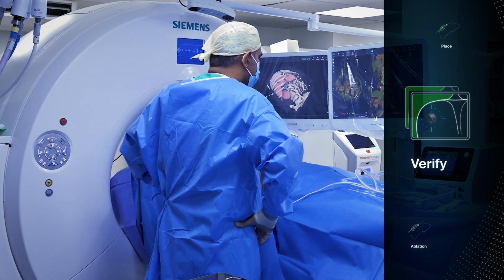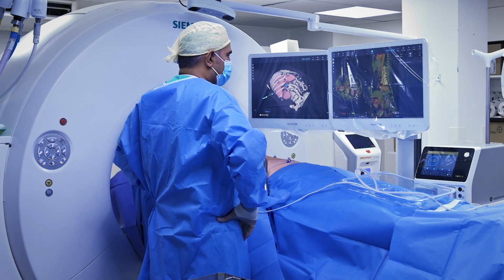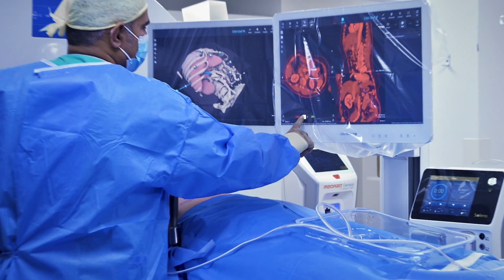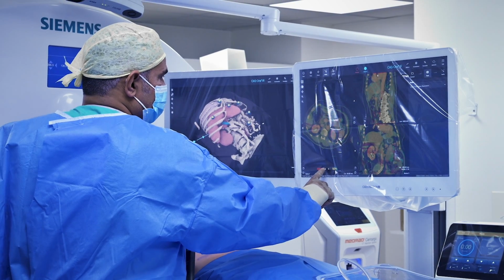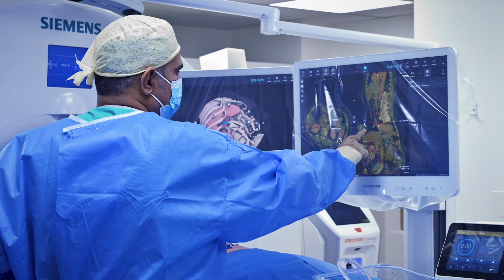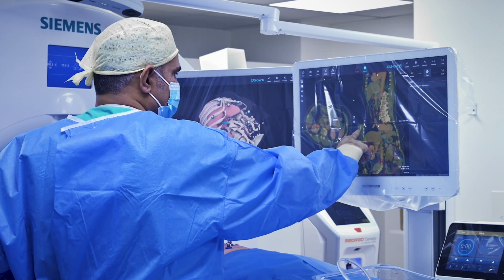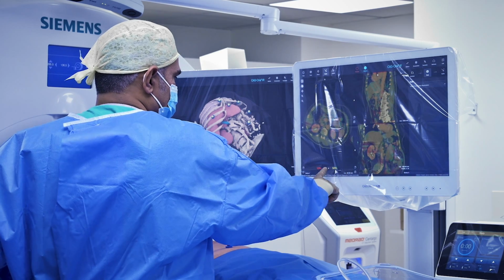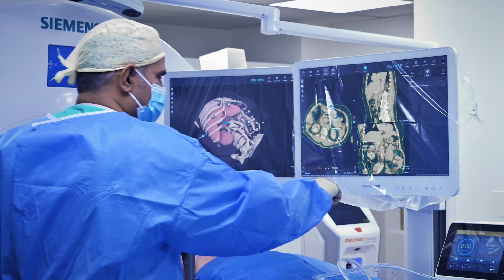So we've now got a needle verification scan, and what we can see here is part red, part green. The red is the original CT scan we did, and the green is the one we've just done after we've put the needle in. What I'm looking for on the 50-50 scan is, is there any significant evidence of motion in between the two? So do you see the red and the green separately around the edge of the liver? And in this case, there's very good control, and we don't really see any significant movement in between the two scans, which is fantastic for us.